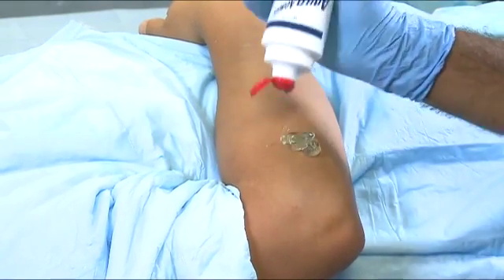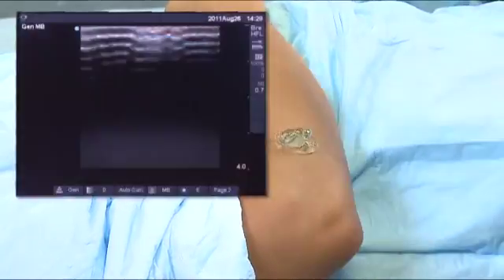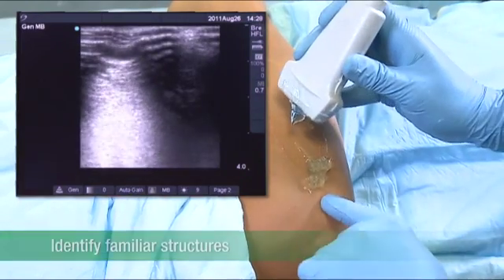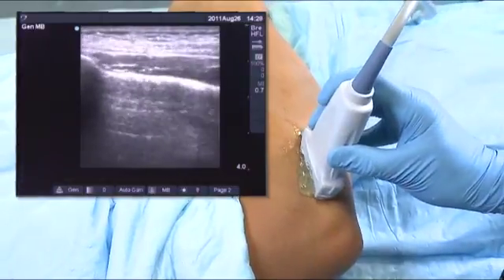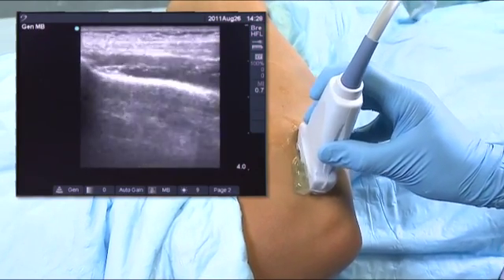Some of the approaches to get a good image using the transducer is, as you place the gel, to identify structures that you are familiar with. For example, in this view here, my finger is right on the epicondyle, a bony structure. So I'll put the transducer right on the epicondyle so that I can identify that bony landmark.